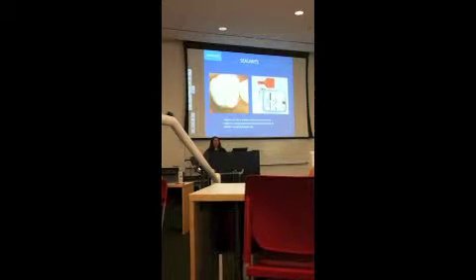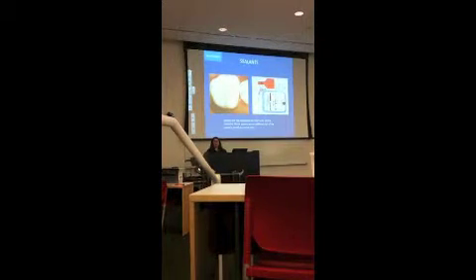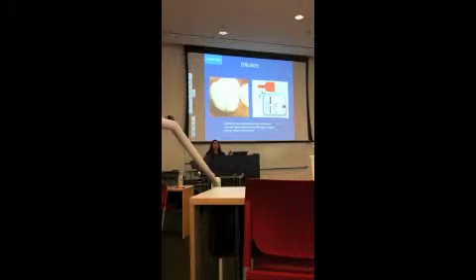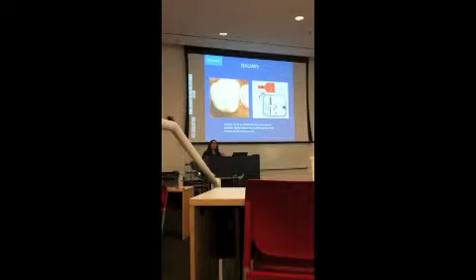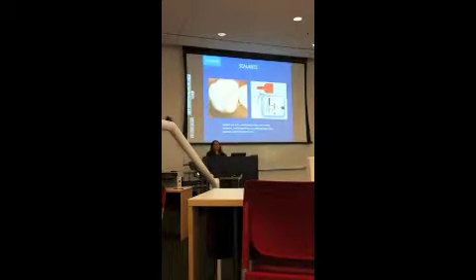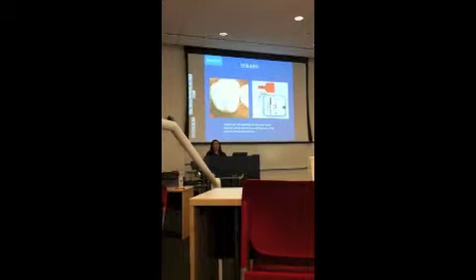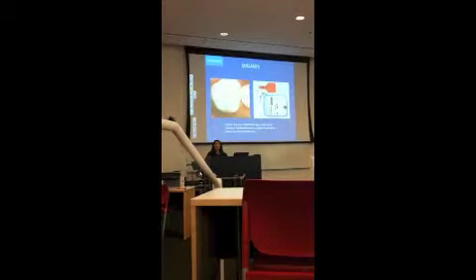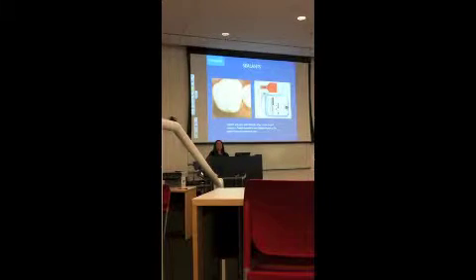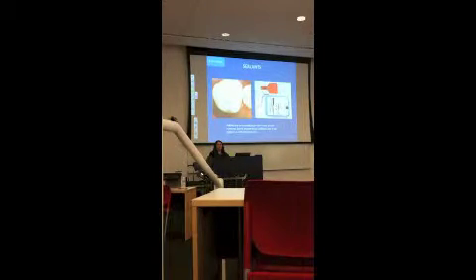Okay, and then your patient and you both need to have safety glasses, and then this protective shield. Do you have a shield that's automatically on the light in your clinic, or do you have glasses that you use? It's on there already? Okay, great. In some dental offices, they may have these older types of lights, and so if you don't have the shield on there, just ask, and they should have this one that you can use, okay?